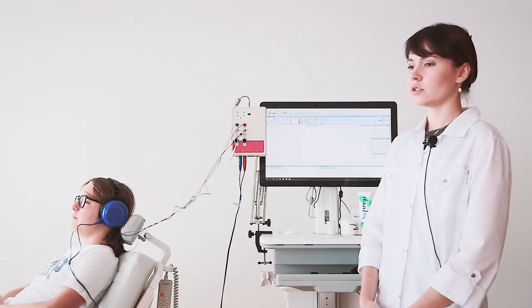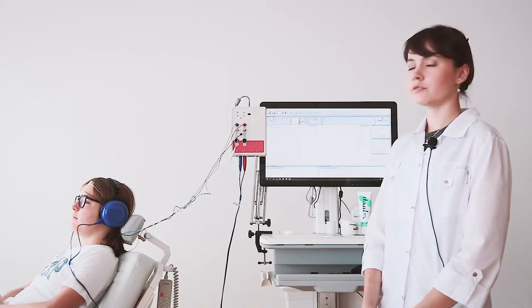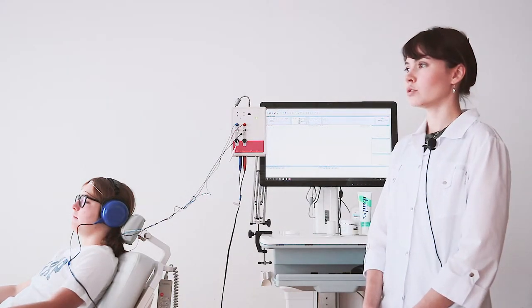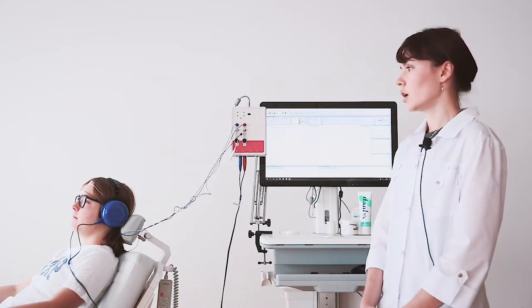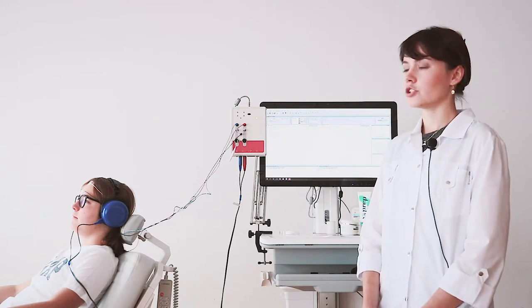To evaluate the cognitive function of our patient, we can perform such tests as cognitive evoked response, for example, P300 or mismatch negativity test. Note that in the P300 paradigm, you should keep the active attention of your patient. For example, the patient should count rare deviant stimulus between non-target and non-rare stimulus. And in a normal functioning cortex, you will get the additional wide positive wave with a latency near 300 milliseconds.